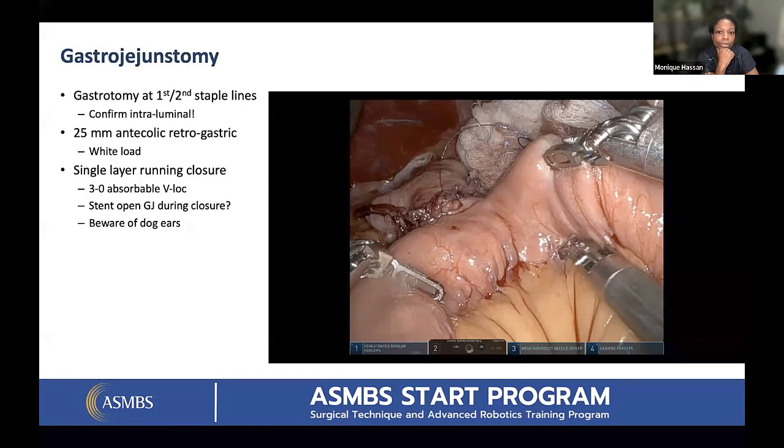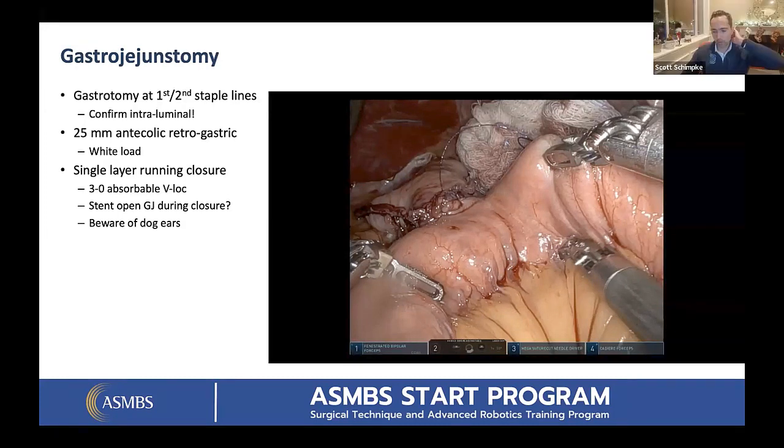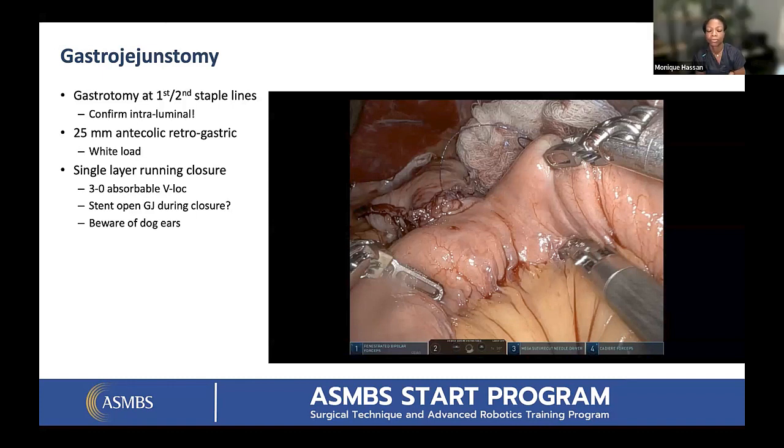I didn't know, obviously you've been doing single layer and so it's been working for you. I do take about 3 or 4 more stitches past the anastomosis. So once it's closed, I take a couple more to make myself feel better. Because you're not tying it, I want to make sure that if it were to come unraveled, say one loop or so, your anastomosis doesn't open up. And again, if it doesn't look great, I absolutely won't hesitate to put another stitch in there. But if it looks fine, that's all I do.